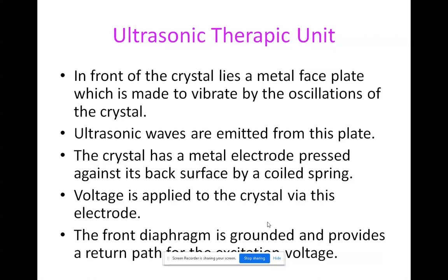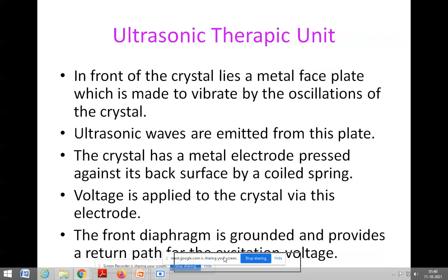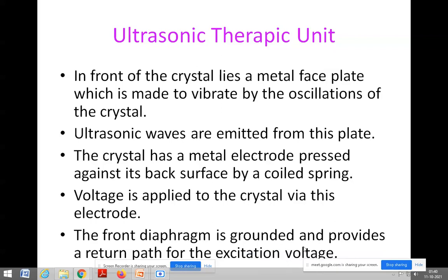So voltage is applied to the crystal via this electrode. The front diaphragm is grounded and provides a return path for the excitation voltage.